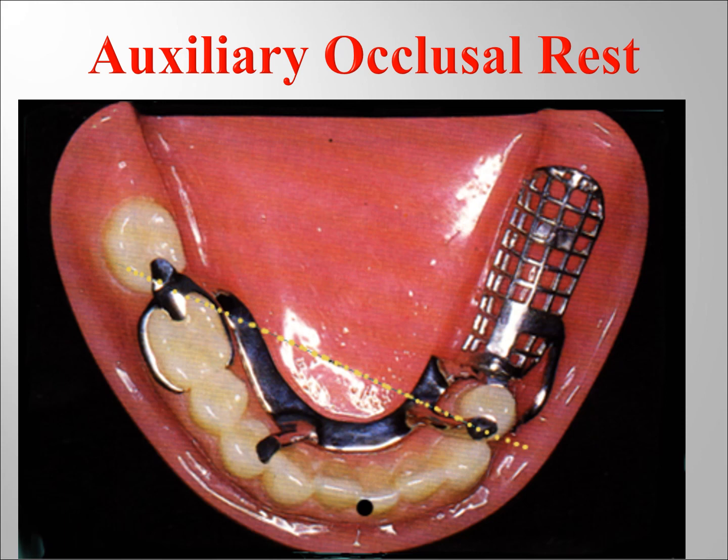So if you have the option, even if it's closer to the fulcrum line, use an occlusal rest, because it provides better support and thus better indirect retention than the cingulum or incisal.